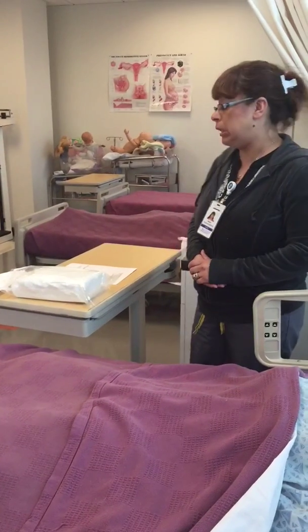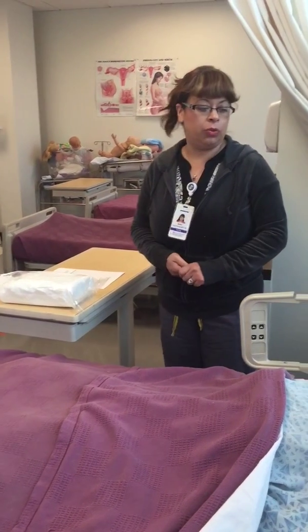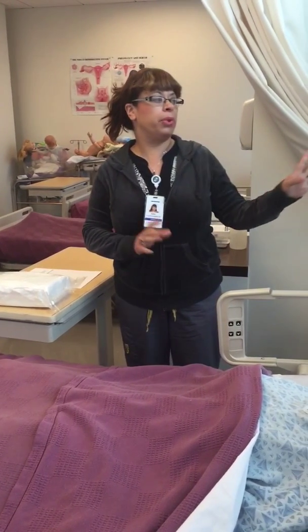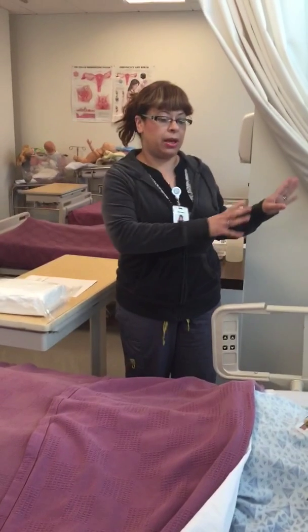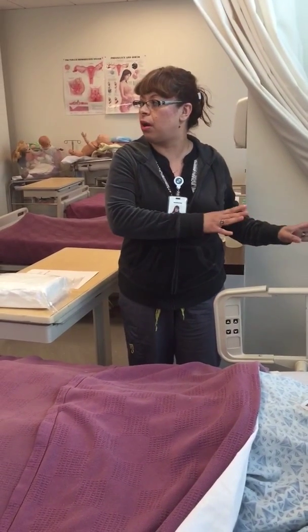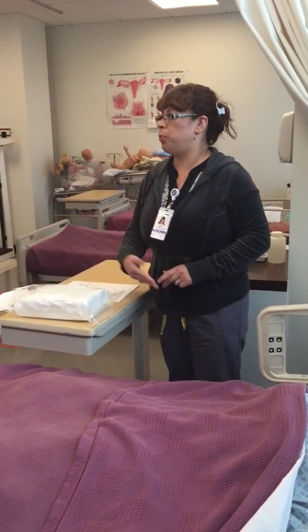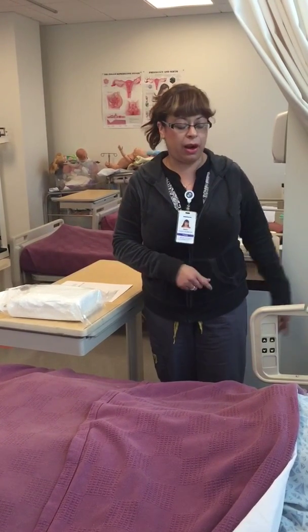With this one, you definitely need a doctor's order. And of course, you want to identify the patient. If you go to a facility where they actually have a computer, you can verify the order there. But let's say we're in a facility where they have charts, so I would have checked my order prior to coming in. But you have an option as well.